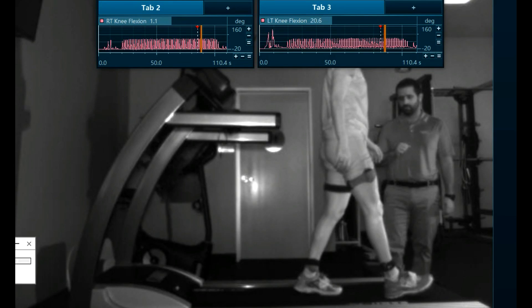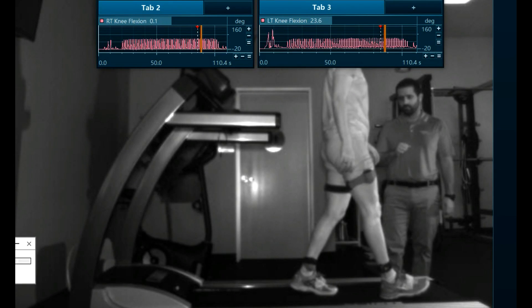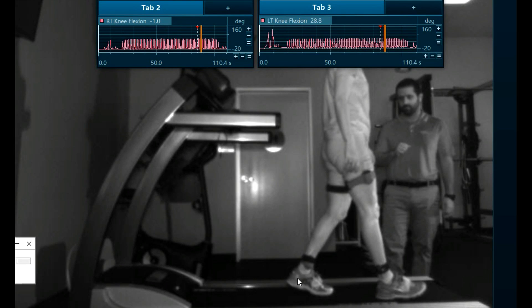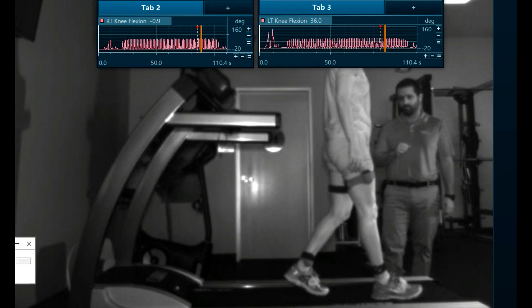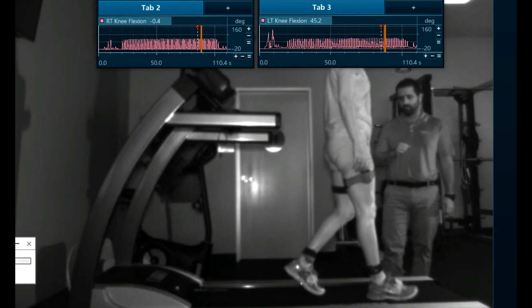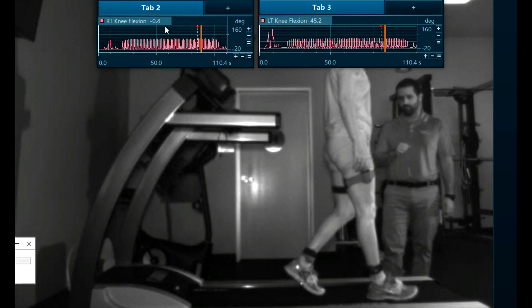As we increase the video frame by frame, you see the forefoot start to approach the treadmill and the heel come up off the back leg. We term this phase loading response. What happens here is we'd like to see the knee flexion angle increase to approximately 15 to 20 degrees. What we see here is the knee actually goes into full extension, even a little hyperextension.